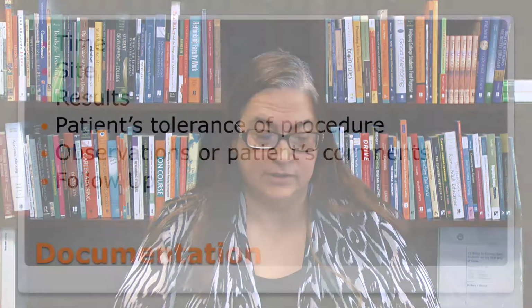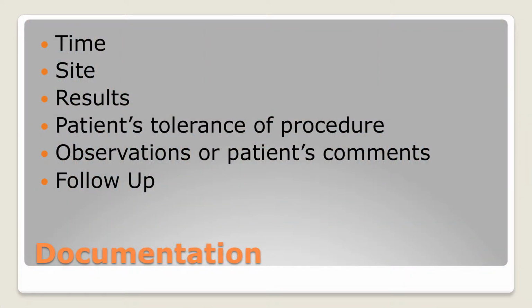Always want to make sure that you document as close to the event as you can so that nothing's missed, nothing's forgotten, nothing's confused with somebody else. The things that you want to document are the time, the site. Where did you get it? That way if they wind up with an infection or something, well, that wasn't where I stuck them.